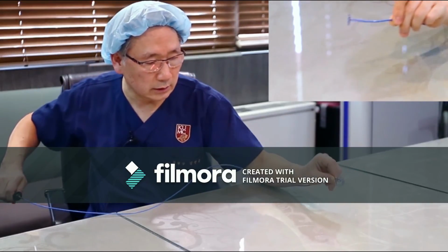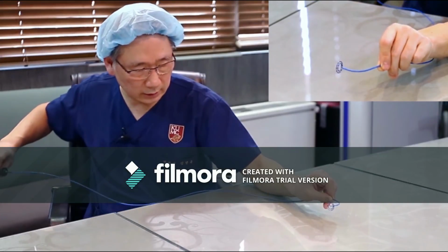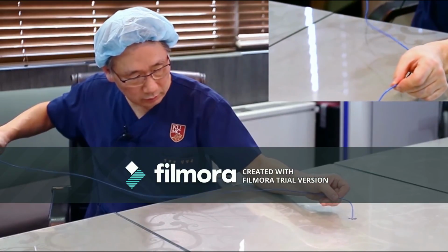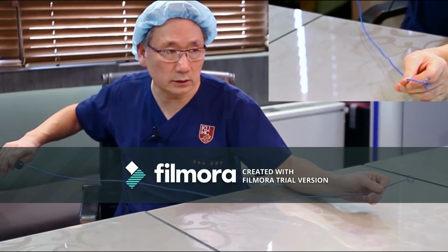And then also from the RIPV, you can do it directly, a little bit more clockwise is the right side. I did the clockwise, not the counter-clockwise.